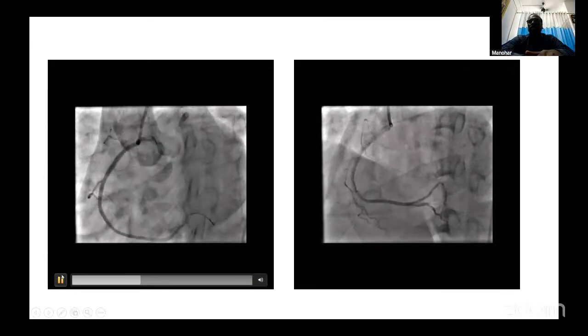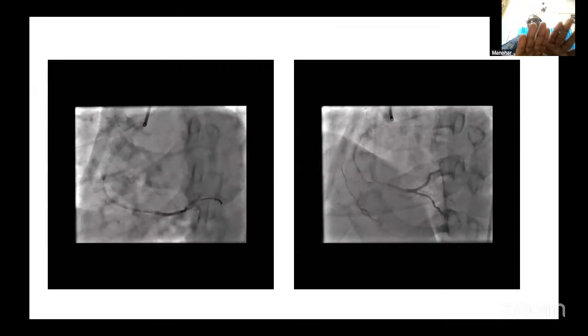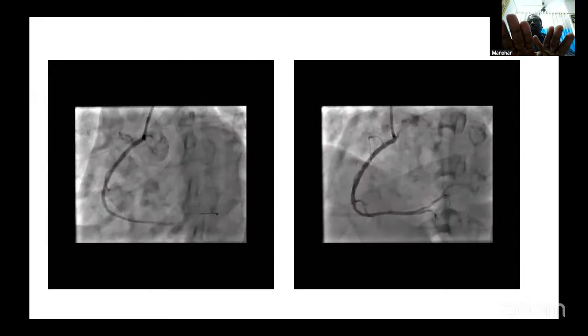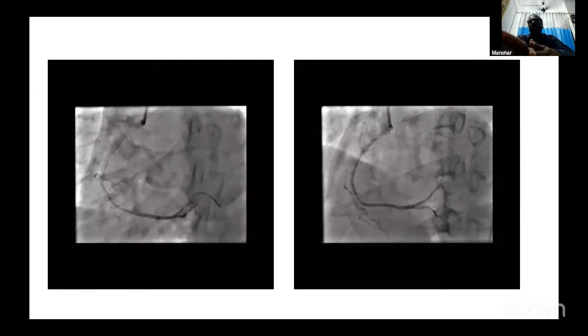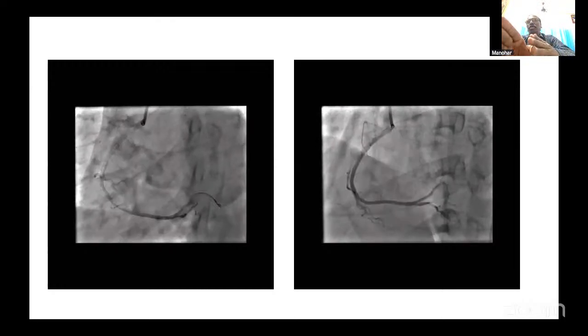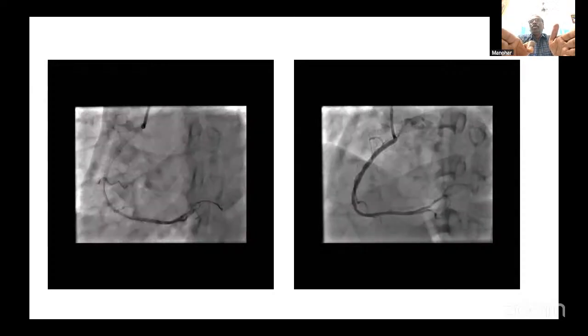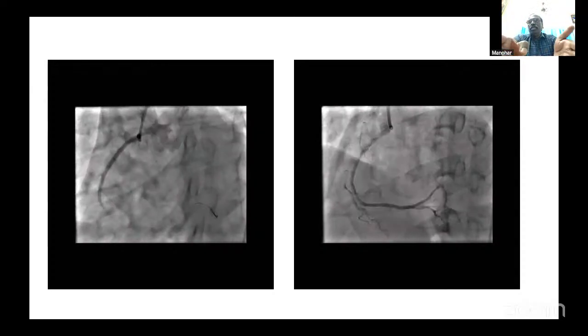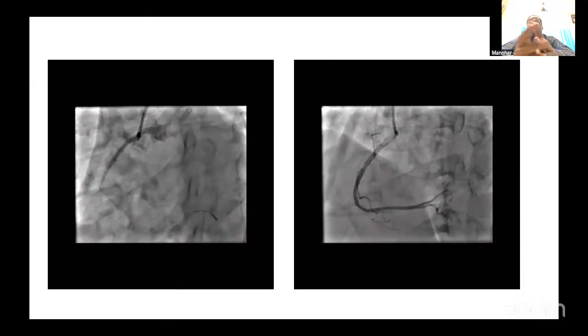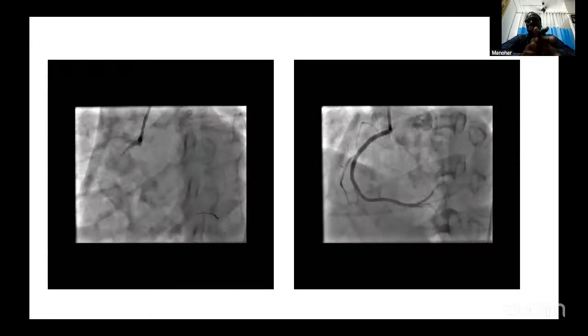In all cases, without stent enhancement or stent booster, I post-dilated with 1:1.25 balloon sizes. Suppose I use a 3 mm stent in LCX, then I use a 3.25 to 3.5 mm NC balloon, post-dilated within the marker. So I avoided stent enhancement and radio zoom, that is stent booster. So the radiation dose to the patient as well as the operator is reduced.